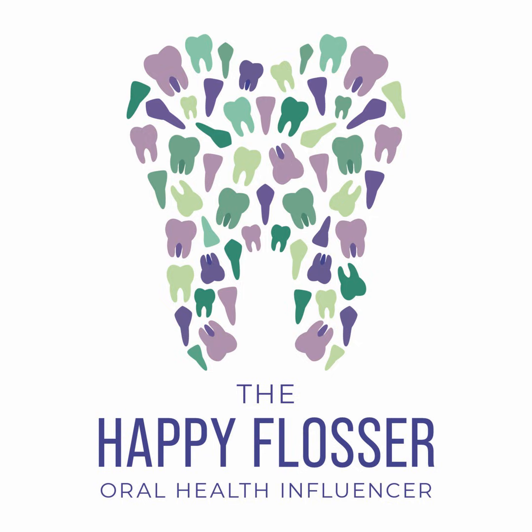When you're doing the mandibular central lateral incisor image, you want to place the sensor centered between the two mandibular central incisors. Move the tongue out of the way. You don't want to rest the sensor on the patient's tongue. The image should capture the centrals and the laterals, and sometimes you may get a section of the canine as well, but the central ray should be directed between the mandibular central incisors.